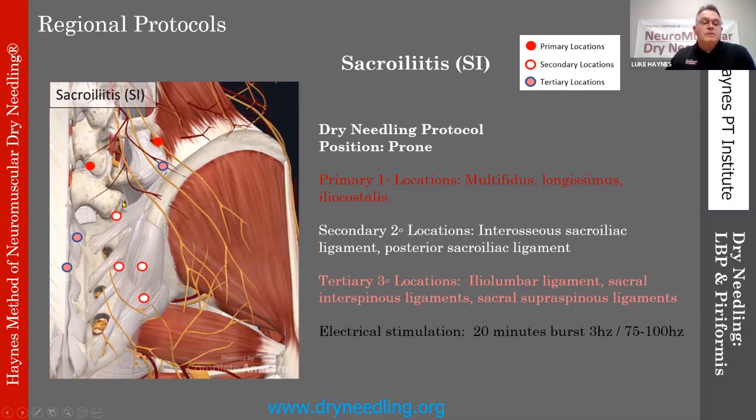So I'm going to get a lot of movement in here. In the coursework that I teach, this is included in the third course, dry needling all of the specific conditions, say for sacroiliitis, and we talk a little bit more about the needle placements there. But the short version is any of this ligamentous structure, including here on the PSIS, which I include for sacroiliitis, would be a nice approach.